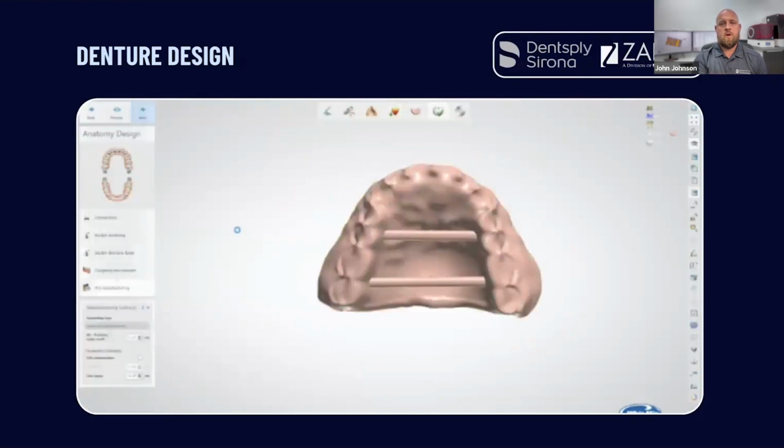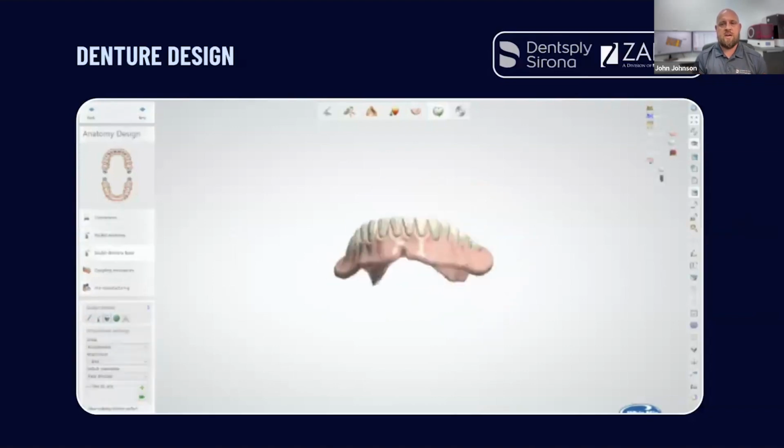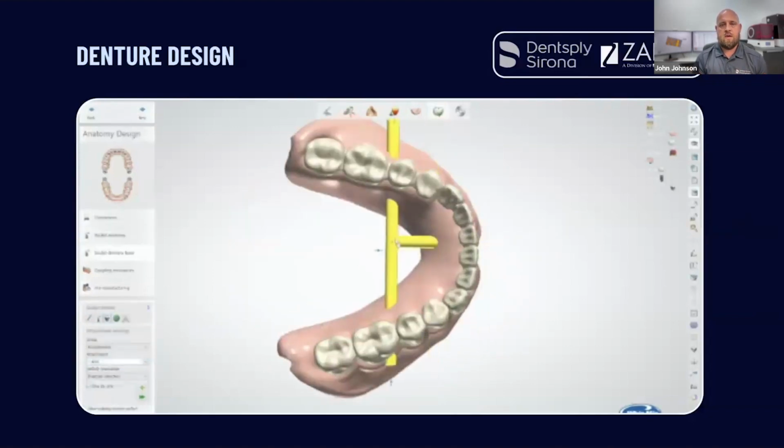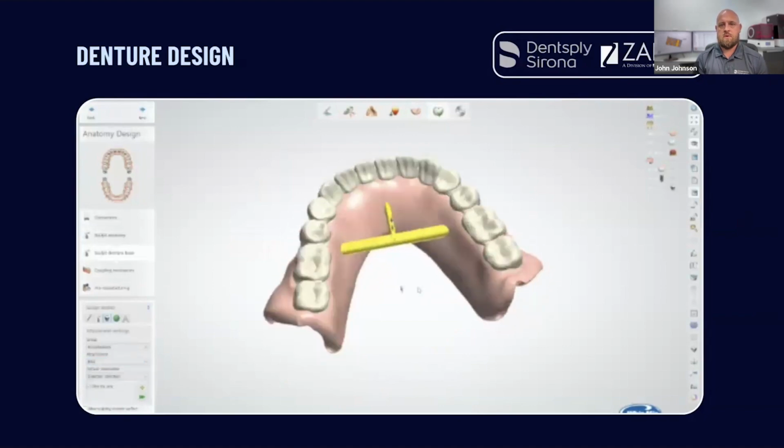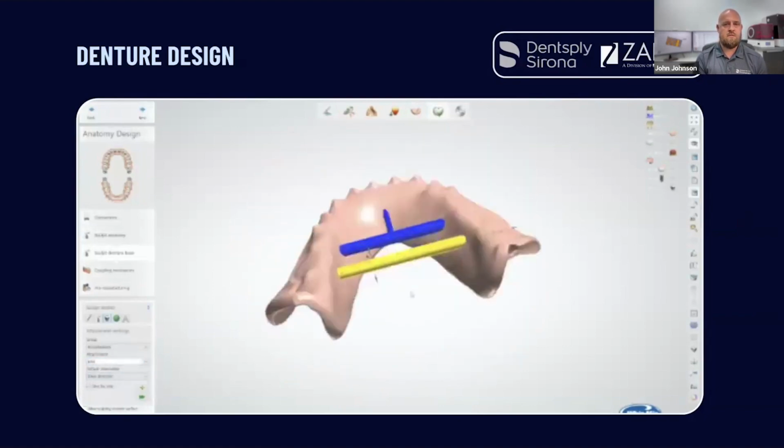And then it's going to run through and make the copings for all the denture teeth. So it's like creating those sockets. And then the final step is where it's going to create all your outputs. It's going to cut right at that CEJ and give you a monolithic denture. It'll give you the upper lower monolithic, which could be considered your try-in dentures.